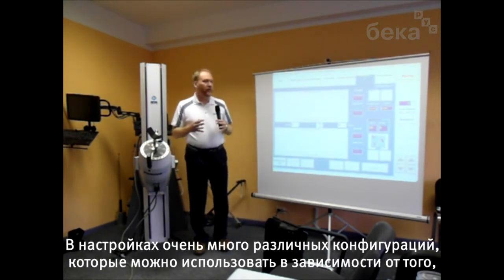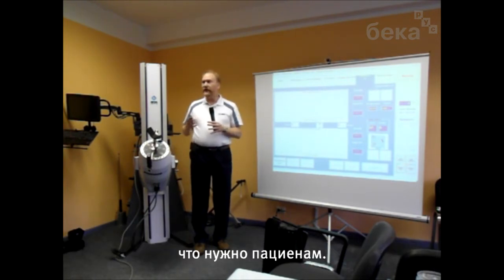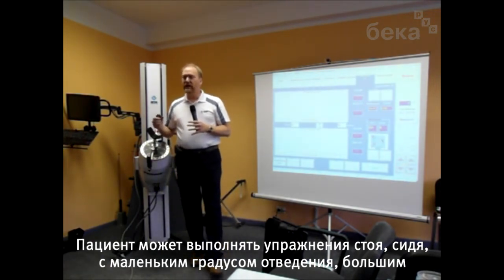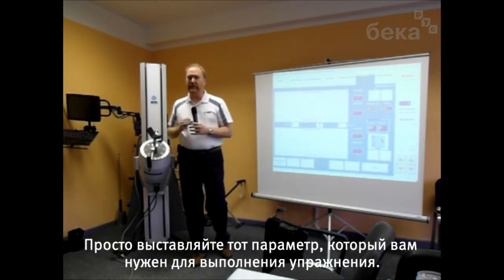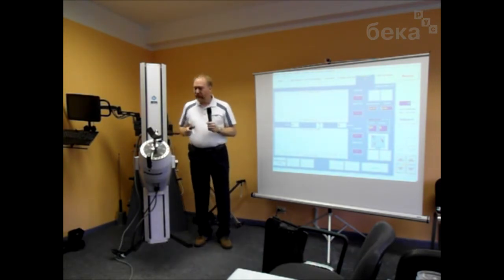So as I mentioned before, for setup, there's a lot of different configurations you can use for particular patients, depending on what their needs are. You can have them do the exercise standing or sitting. You can do it at a small degree of abduction or a large degree of shoulder abduction. It just depends on where that person needs to be for the exercise.